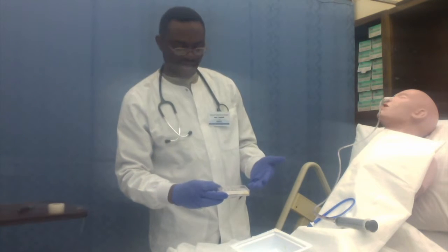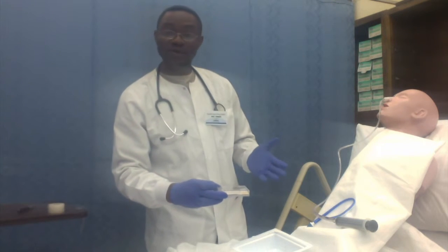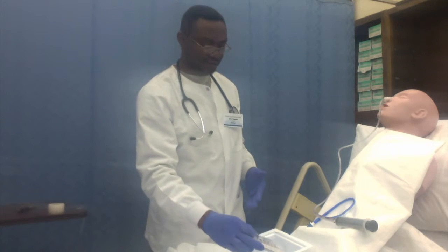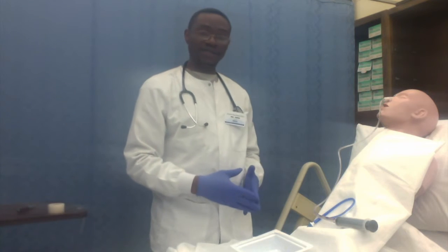If the reading is above 4, that is, let's say from 6 upward, then I will know that I misplaced the tube, probably in the lungs. But to confirm further, I will ask my patient to have an X-ray.